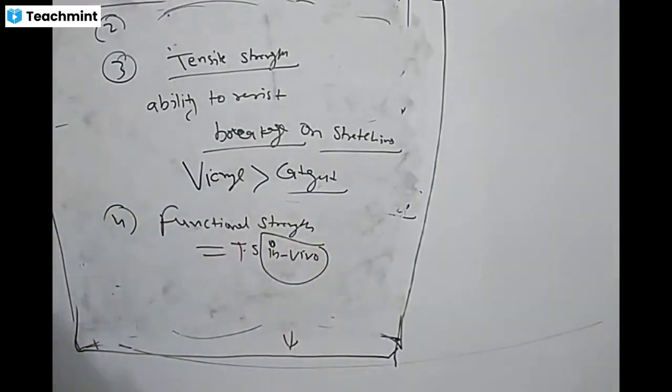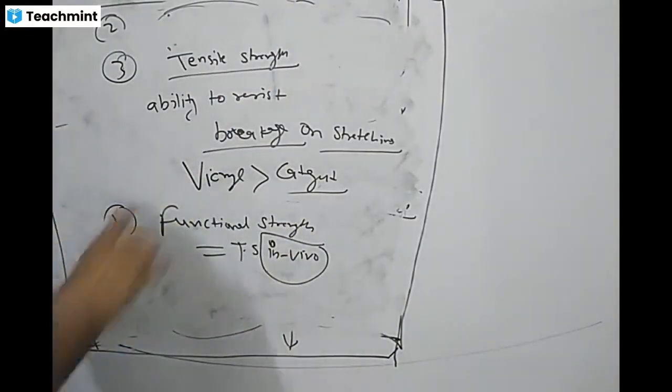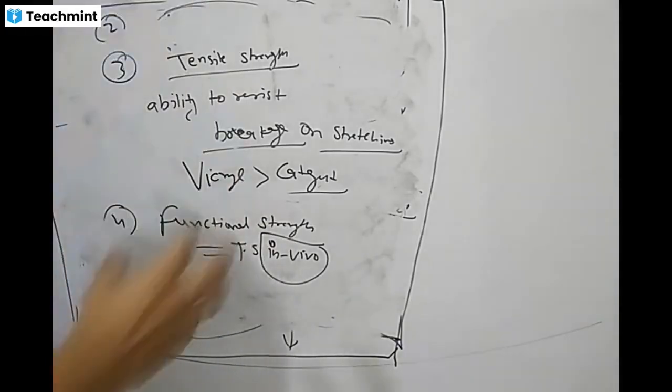The owners come with the complaint that the suture material opened, it dehisced and the abdominal viscera came out. So it is advisable to use material which has good tensile strength. If you are doing the linea alba approach for your OHE, the suture material at the linea alba should have good tensile strength. Otherwise, if you apply a fiber which breaks down, then all the content will come out.